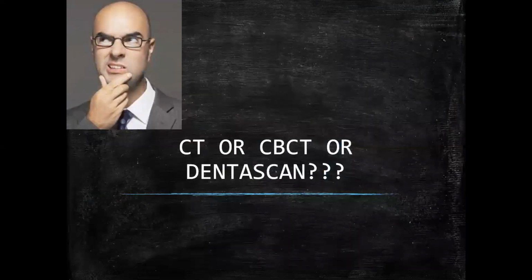But in my brief career of 4 years, I have come to know that there are misconceptions among many dentists. Some use the terminology CT scan, some use CBCT, some use DentaScan. Let me clarify before we start. DentaScan is just a software which is used in CT scan. And today, we in dentistry more professionally use CBCT.